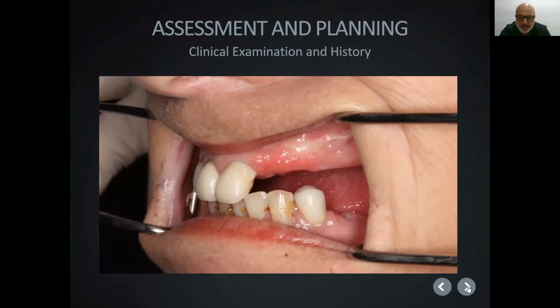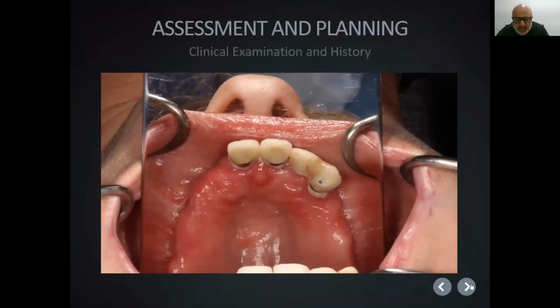It shows a history of neglect to some extent, but we don't know why this has occurred. This may be cumulative after a traumatic event, or it may have been phobia or something along those lines. So without judging, we are just basically looking at what we see. There's also, looking at the next ones we discussed last time, some raised lesions.